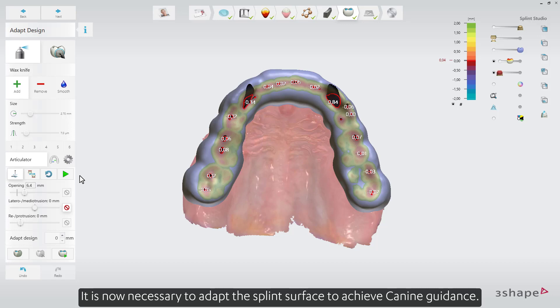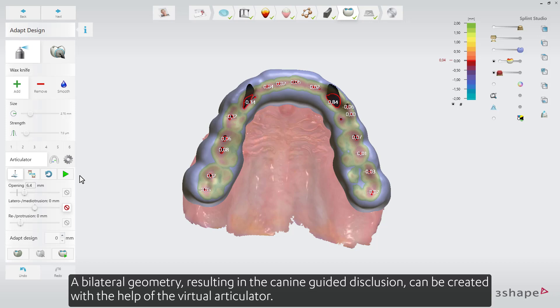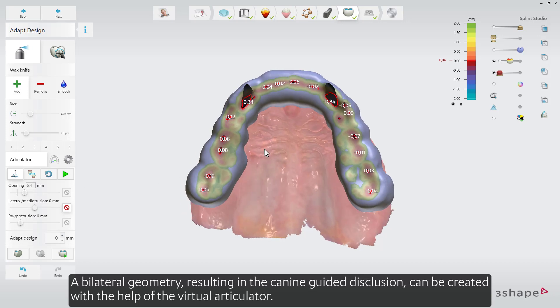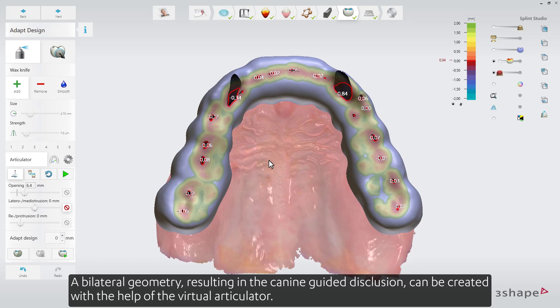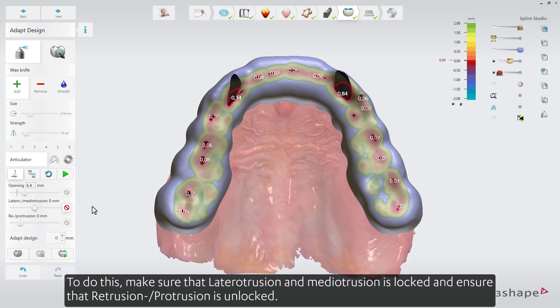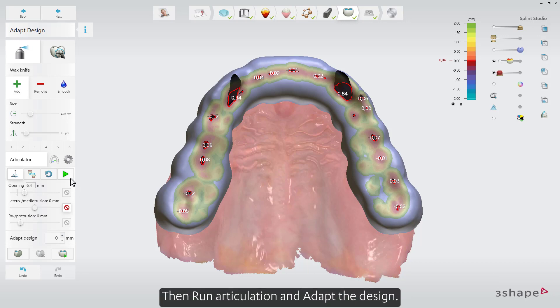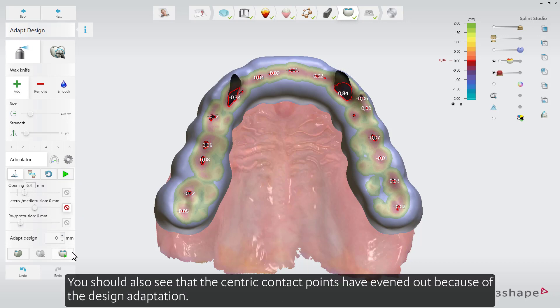It is now necessary to adapt the splint surface to achieve canine guidance. A bilateral geometry resulting in canine-guided disclusion can be created with the help of the virtual articulator. To do this, make sure that laterotrusion and mediotrusion is locked, and ensure that retrusion and protrusion is unlocked. Then run articulation and adapt the design. You should also see that the centric contact points have evened out because of the design adaptation.